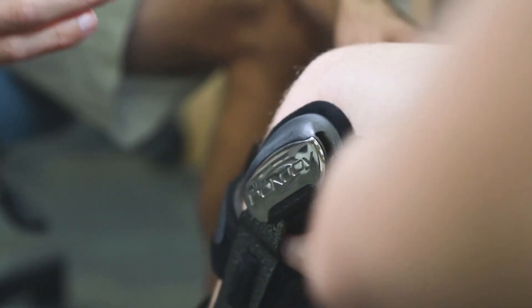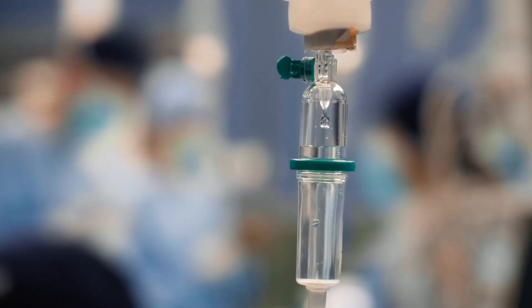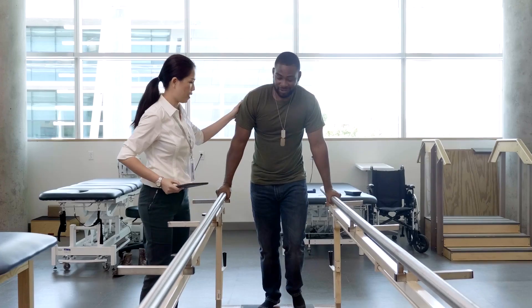The thing I trust the most about Donjoy and the bracing is the constant improvements they make and the quality that they produce in their braces. Also, just the time and energy it could save from surgery costs to rehab and PT if we can keep them on the field and out of this room.